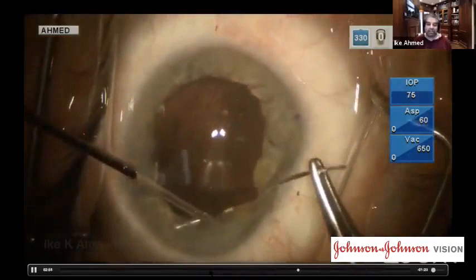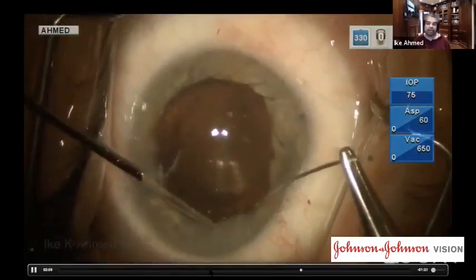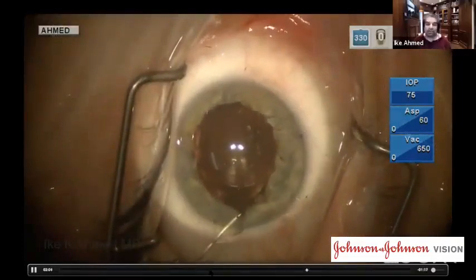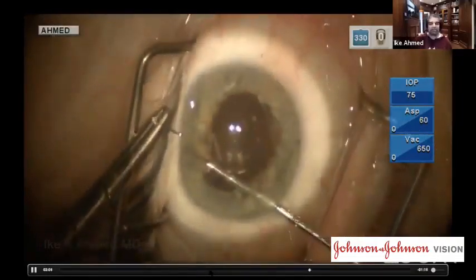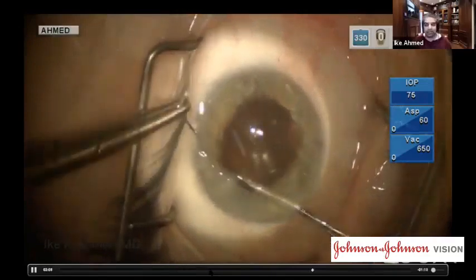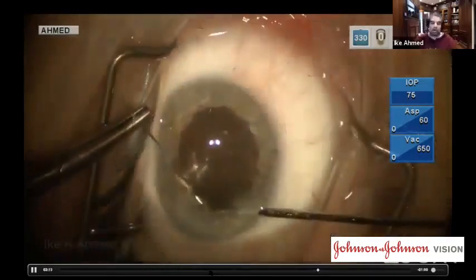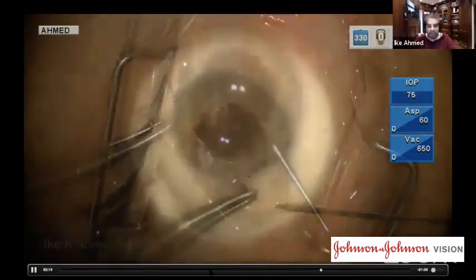These cerclage techniques are helpful when there is uniform atonicity of the pupil and there is no specific focal iris defect. If there is, then using a more localized technique with interrupted multiple sutures may be more advisable, or what we call a partial iris cerclage may be done.